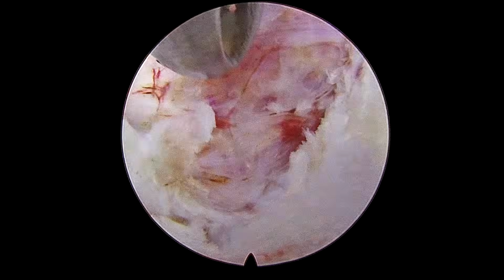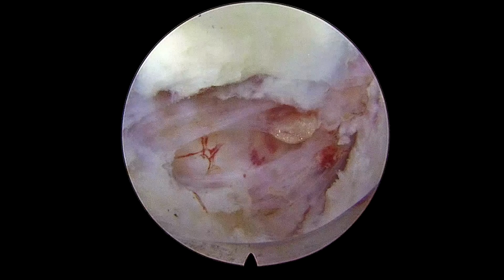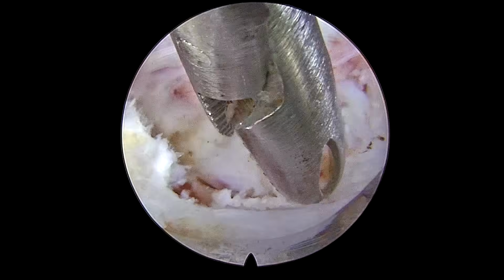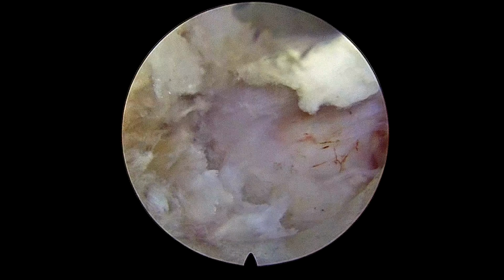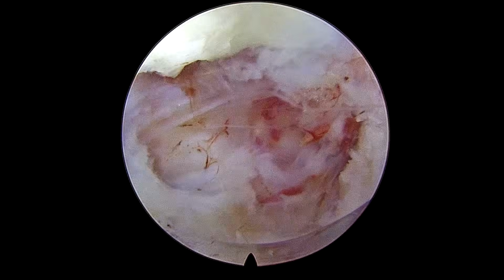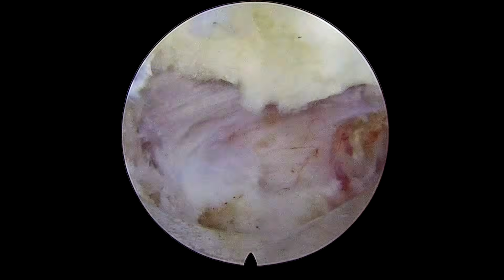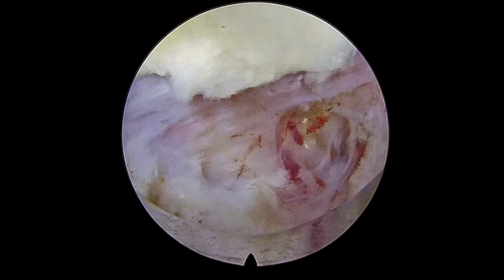So the end point of bony decompression in posterior cervical foraminotomy or discectomy is to expose both the axilla as well as the shoulder. Once you see the axilla and shoulder, that will become the end point of your bony decompression. So now we are trying to delineate the shoulder and axilla of the root. I don't know whether you can recognize here or not. We are already in the shoulder area, and I will try to delineate the axilla. For that I have to remove more bone from the superior aspect.